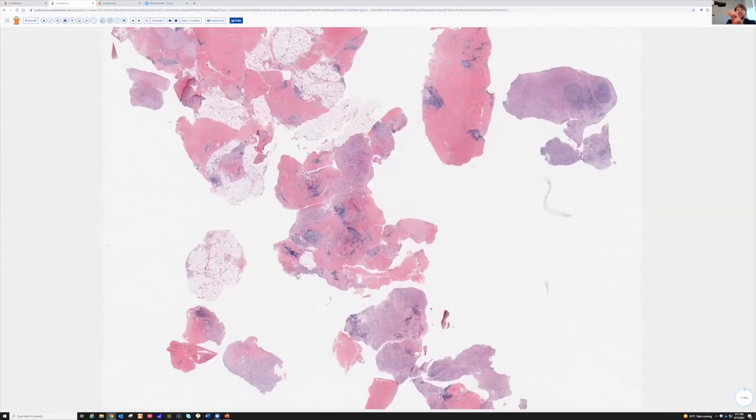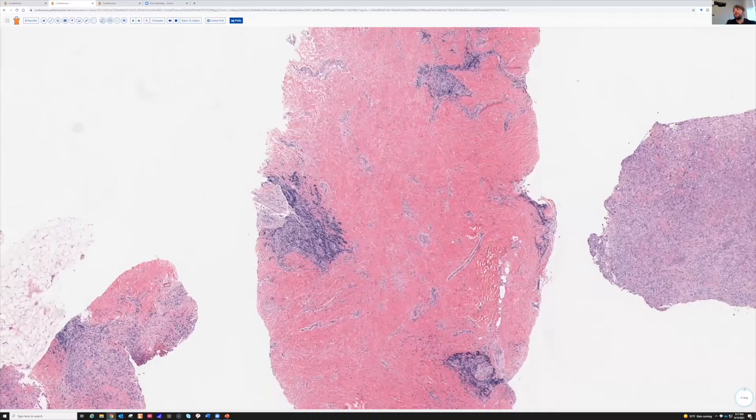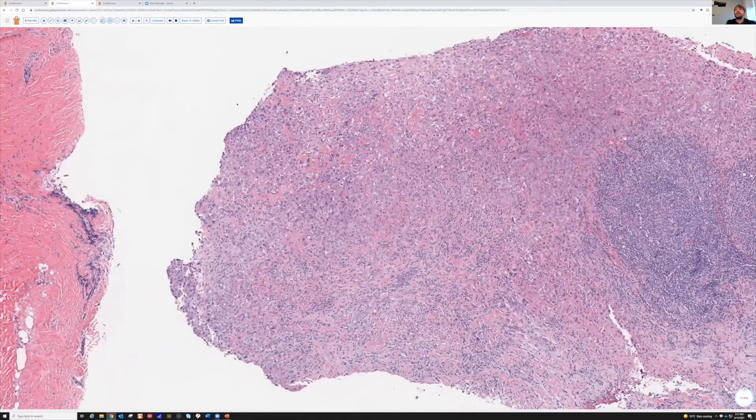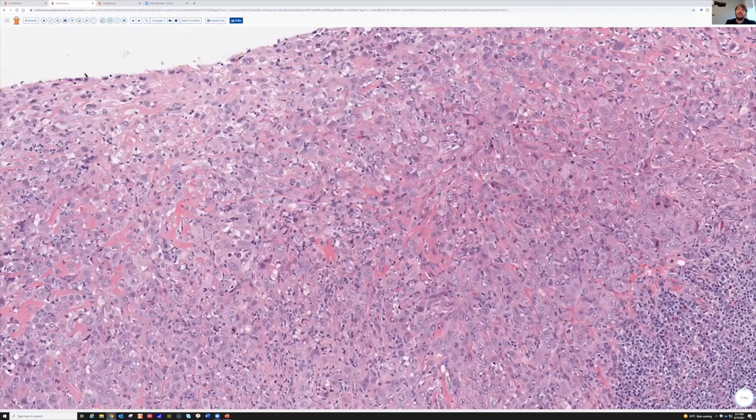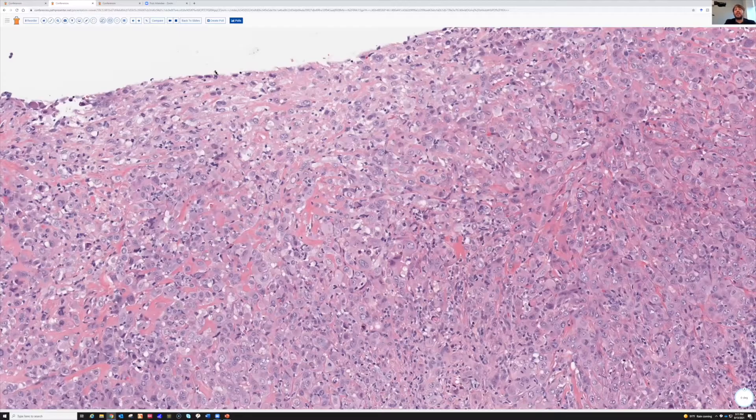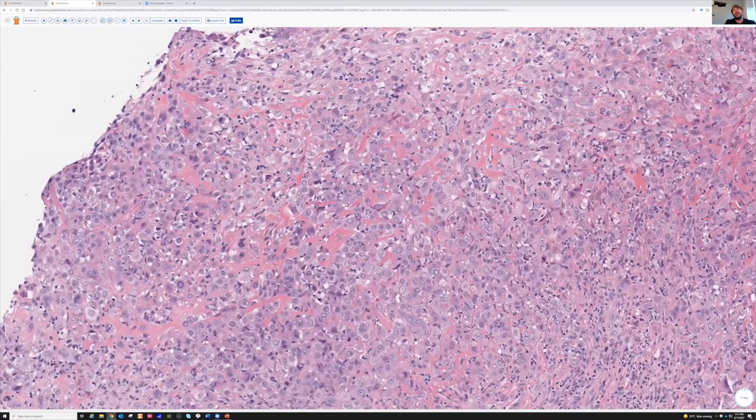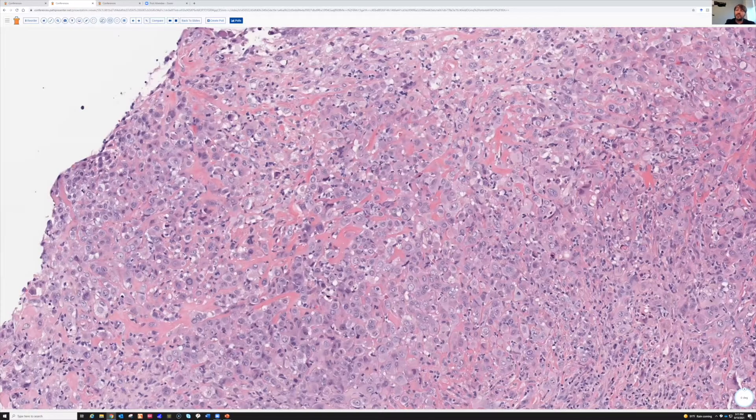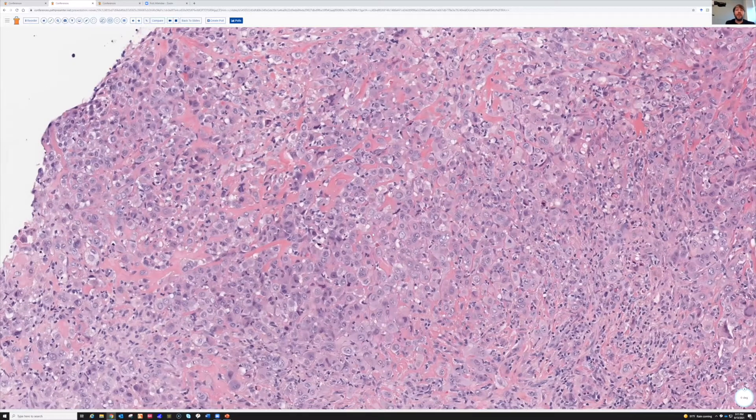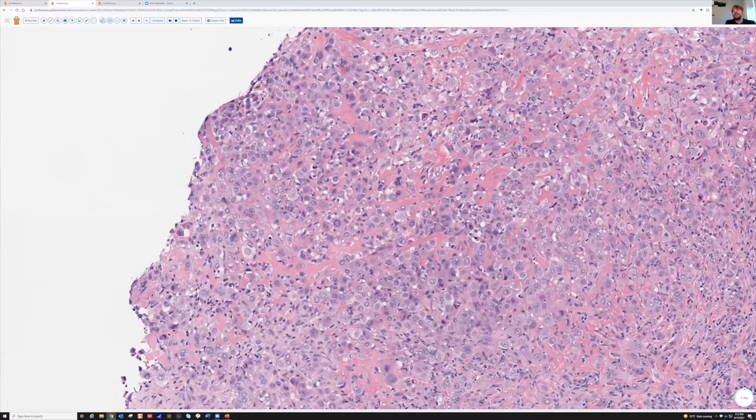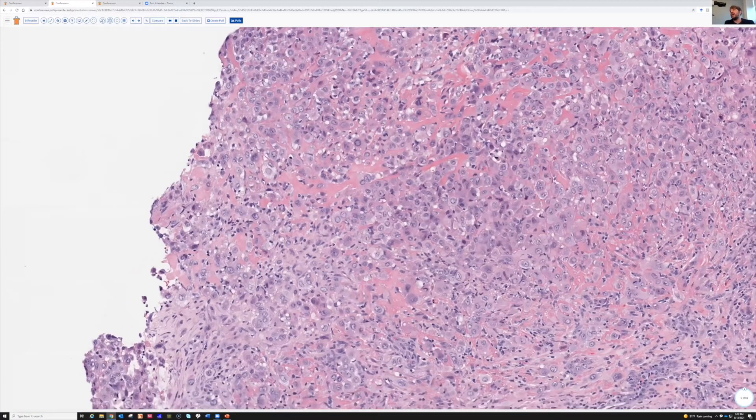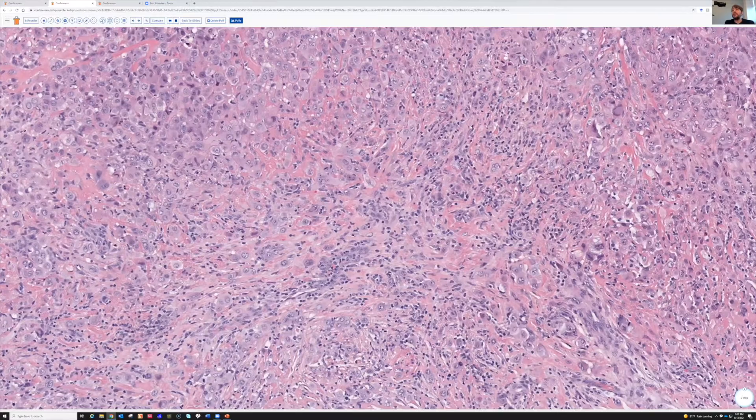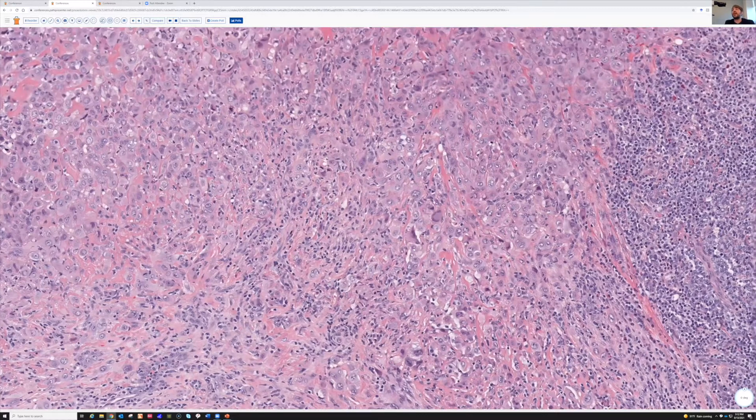You can see dense connective tissue here and inflammation, but then in these pieces there is a neoplasm - sheets of large cells that have abundant pale pink cytoplasm, large pleomorphic atypical nuclei, and the chromatin is very pale and washed out, very vesicular. Look at how loose and open that chromatin is, and these large pleomorphic cells with very pale chromatin and abundant dense pink cytoplasm. On the distal extremity of a young adult or middle-aged adult, what's this diagnosis going to be until proven otherwise?